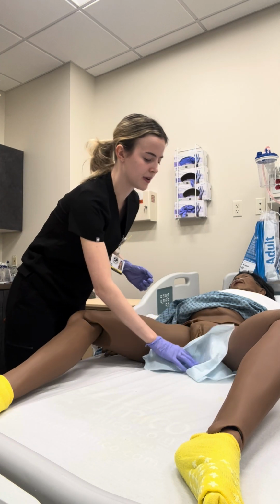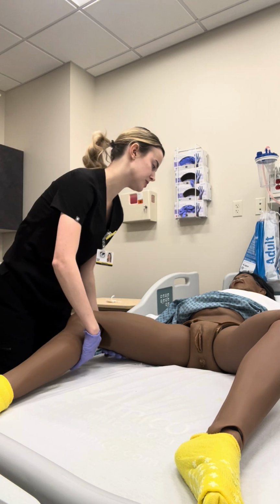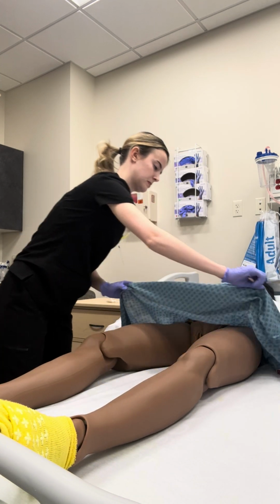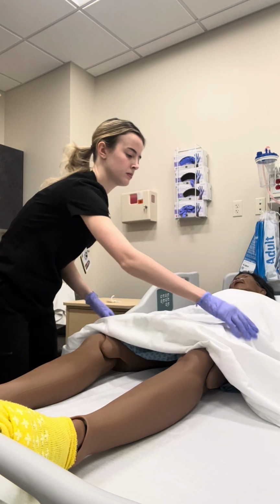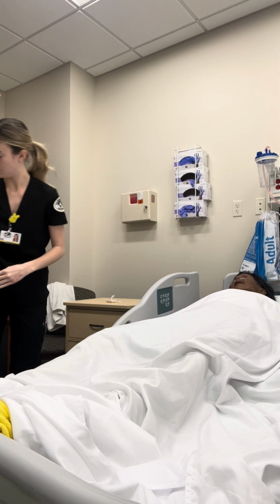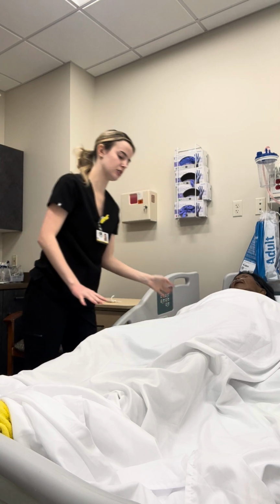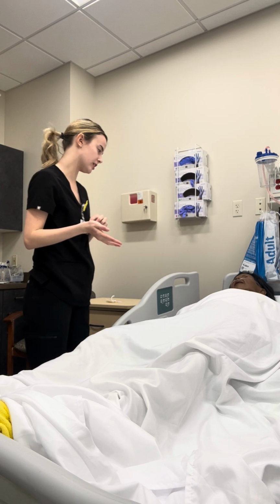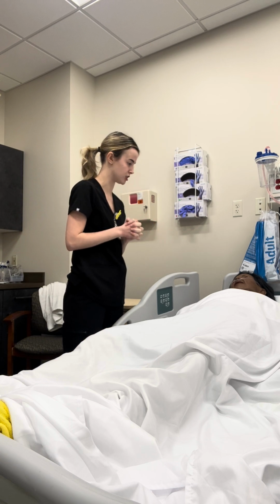Wipe the area. If the patient wanted any peri-care after removal, provide peri-care. I'm just going to help you get back into a comfortable position. Okay, do you want to keep laying down? Perfect, okay. So the bed is lowered, 2 of the 4 side rails are up, call light is in hand. Since that urinary catheter is out now, just let me know when you first use the restroom, and I'm going to come measure that, okay?